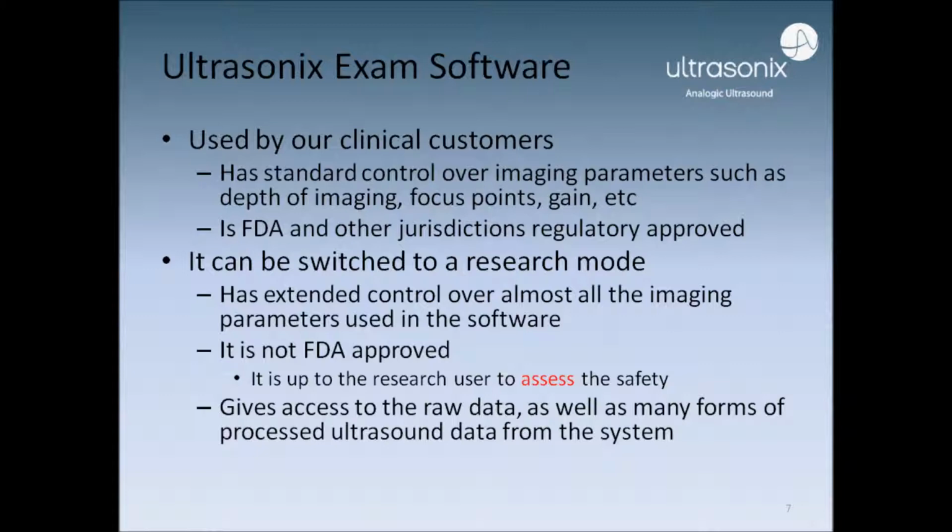The adjustment of parameters in the clinical mode will not pose a risk to the patient, and the output ultrasound energy is always within regulated limits set by these authorities. However, with a research license, the exam software can be switched into a research mode.